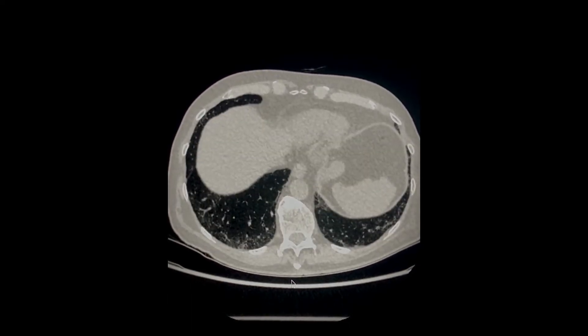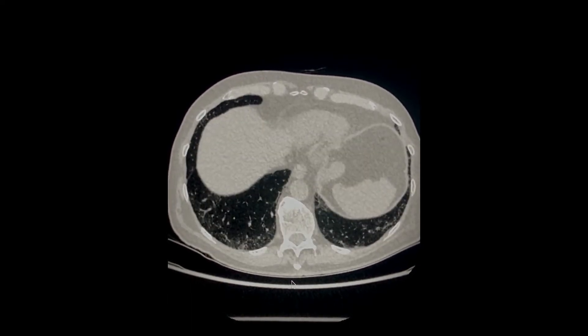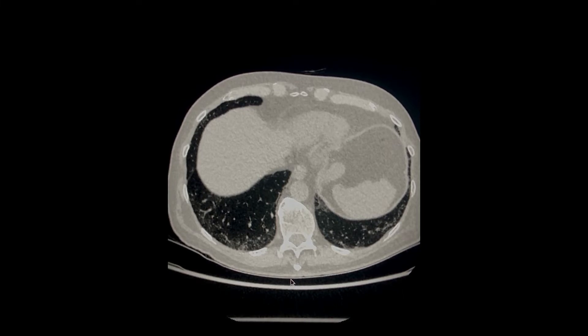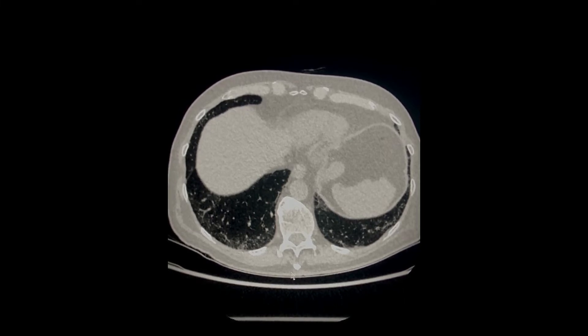In many centers, to further evaluate and confirm this, prone imaging is performed.